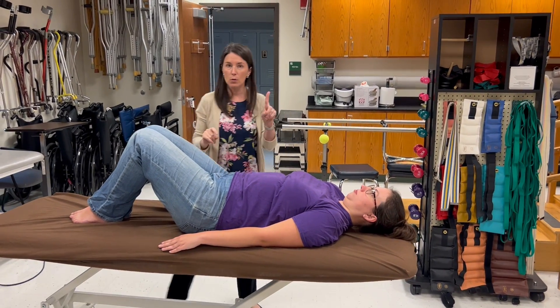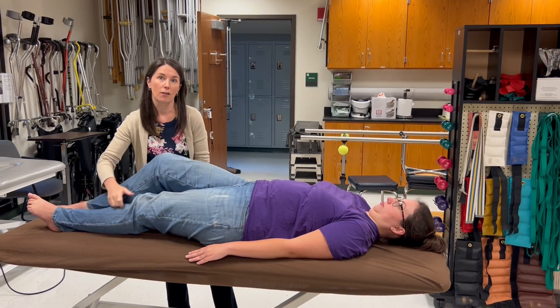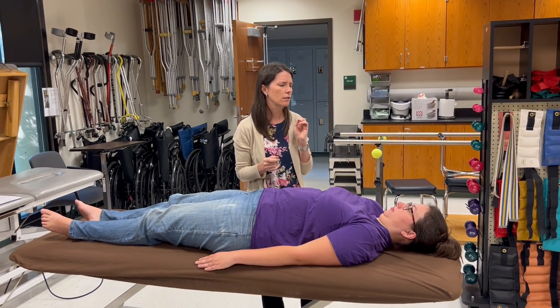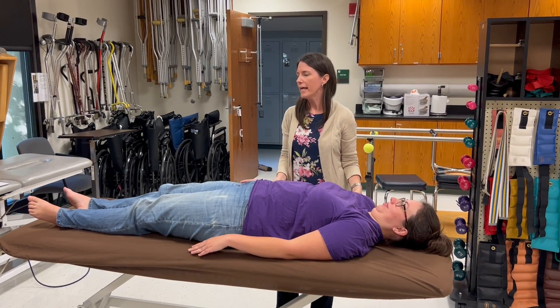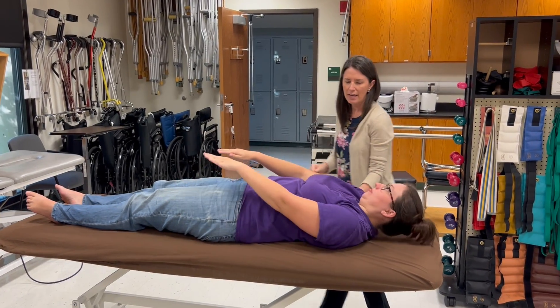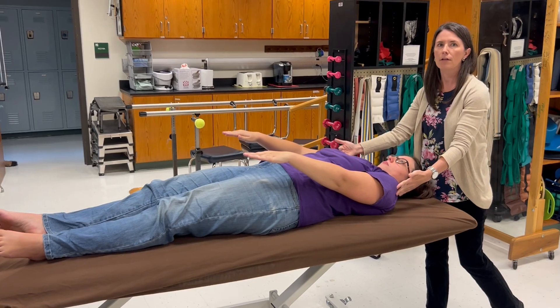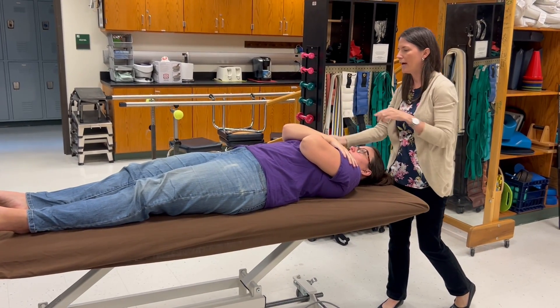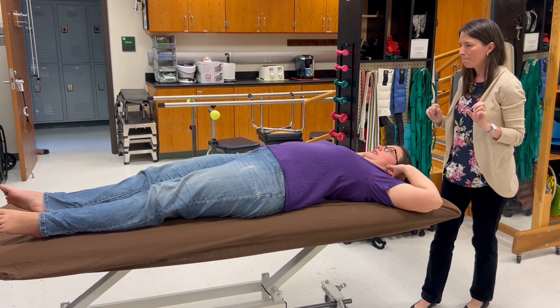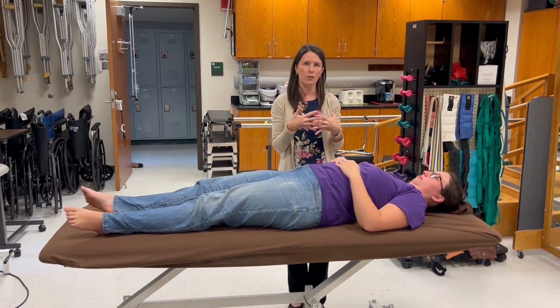There are two methods for testing. One method is to literally test grades three, four, and five for left trunk rotation, then separately test three, four, and five for right trunk rotation. Another way is to combine them: for grade three with arms out, test left trunk rotation first — right shoulder toward the left foot — then immediately test right trunk rotation — left shoulder toward the right foot, checking the left inferior angle. Then repeat the same combined sequence for grade four with arms crossed, and grade five with hands clasped.